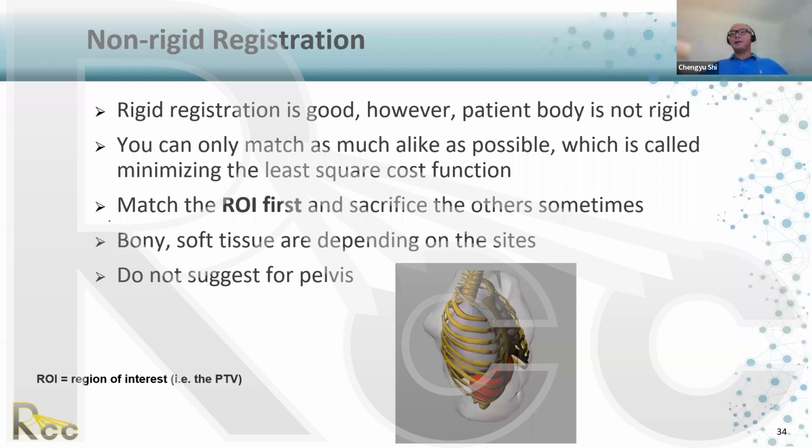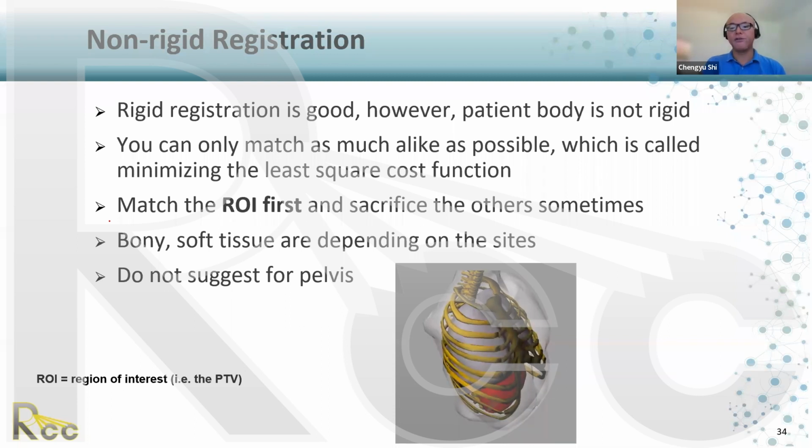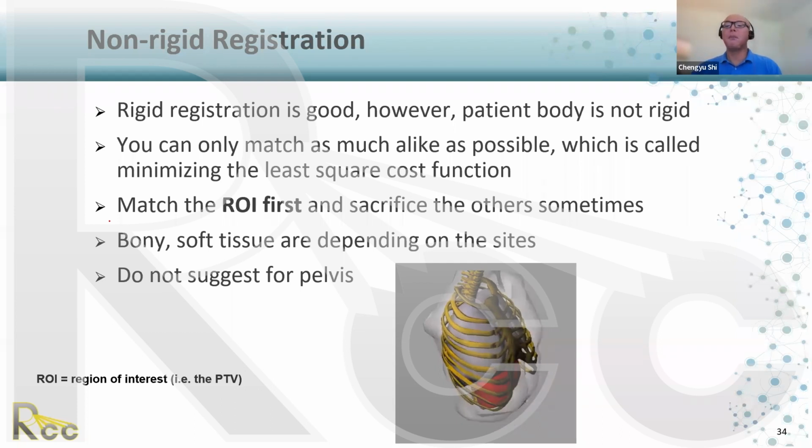So that means if you want to double check your treatment planning non-rigid registration algorithm, use the Task Group 132 phantom to do it first and give you comfort. But I don't believe it. I don't believe it for sure. For research it's okay. For real treatment, I have a big question mark there. I'll put more uncertainty there.